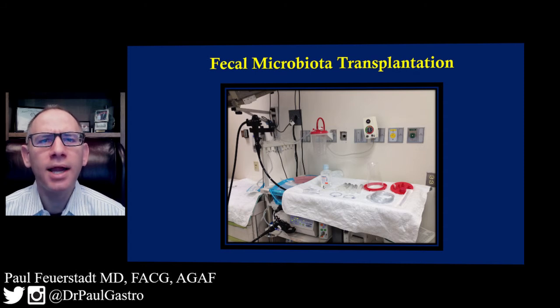At that point, a colonoscopy is performed on the recipient, and during that colonoscopy, the scope is passed to the end of the colon and then into the last portion of the small bowel. Within the last portion of the small bowel, 1 syringe or 60 milliliters is usually instilled. Then in the end of the colon, or the tip of the colon, sometimes referred to as the cecum, 60 milliliters or 120 milliliters is placed. In the ascending colon, just above the tip of the colon, another 60 milliliters is placed, and then approximately 60 milliliters is placed in the transverse colon.